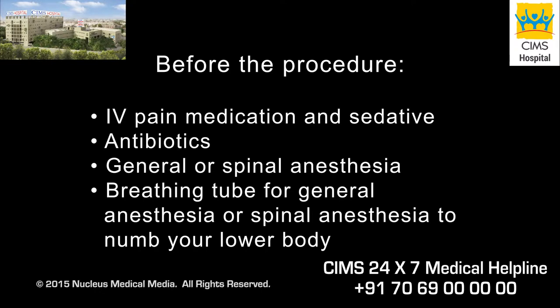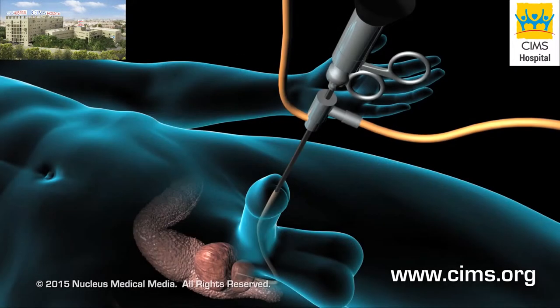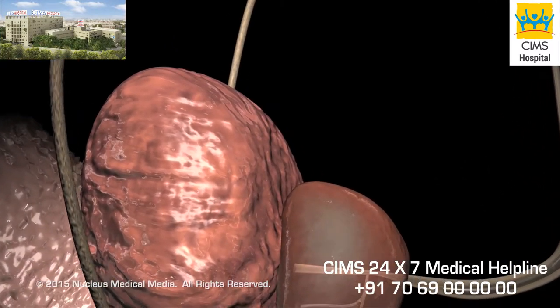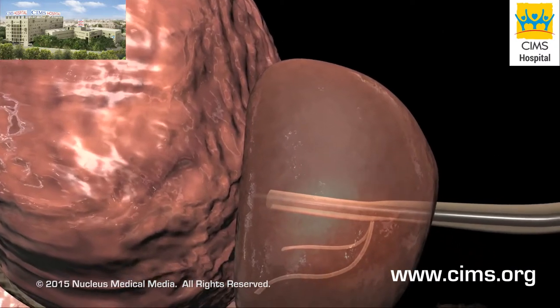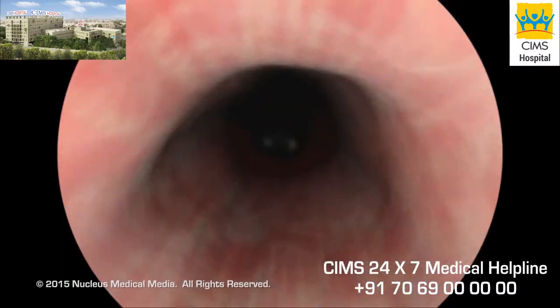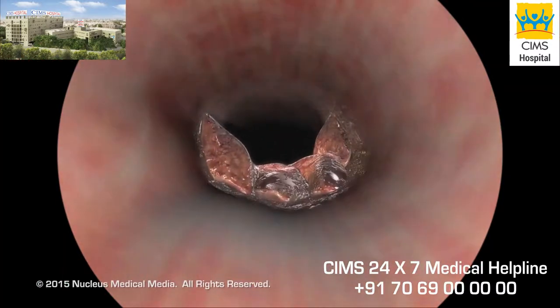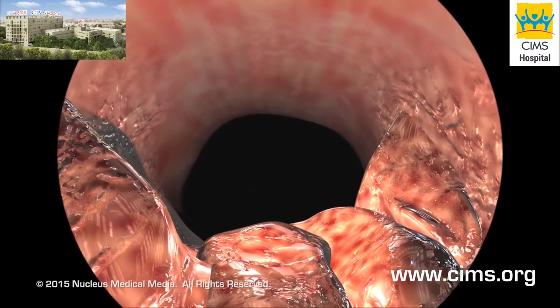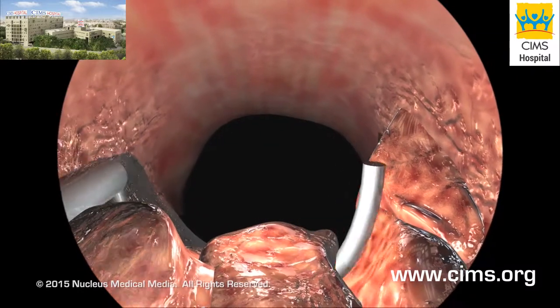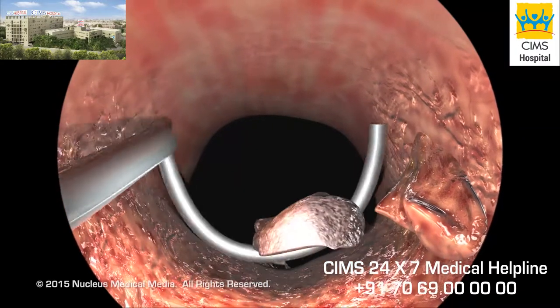An uncomplicated TURP usually takes about an hour to perform. Your surgeon will begin by slipping a small, lighted instrument called a cystoscope through the opening of your penis. After instilling sterile solution through the cystoscope for better visibility, your surgeon will carefully examine the inside of your urethra, prostate, and bladder. He or she will then pass a resectoscope, which essentially consists of a small wire loop carrying an electric current, through the cystoscope and use it to shave off layers of prostate tissue.